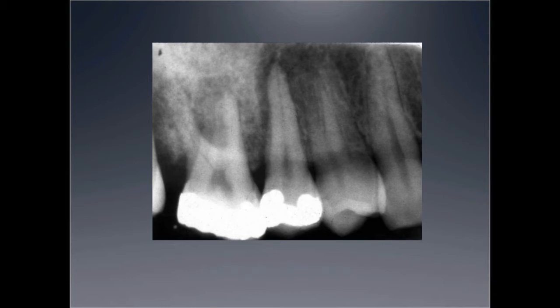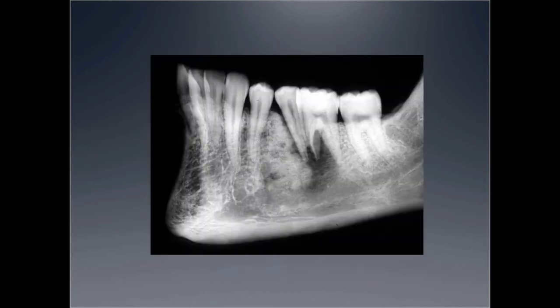Another case of osteosarcoma. This is not a live patient radiograph, as you can tell. This is a resection specimen. It shows you and provides for you a sequence of what happens to osteosarcoma if you leave it alone, and you can see the bone apposition next to the bone resorption. You can see how wide the margins of the resection are and how serious the disease is. Basically, when you have this size of a tumor, you cannot be sure that it has not infiltrated way beyond what you see in this radiograph.